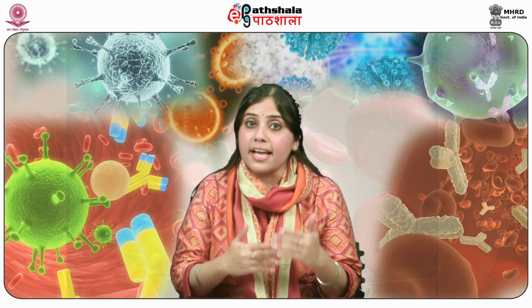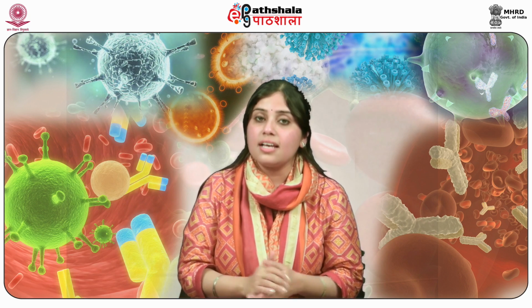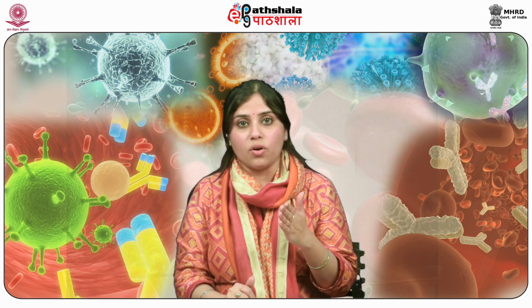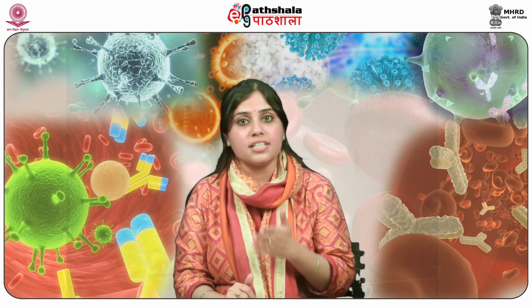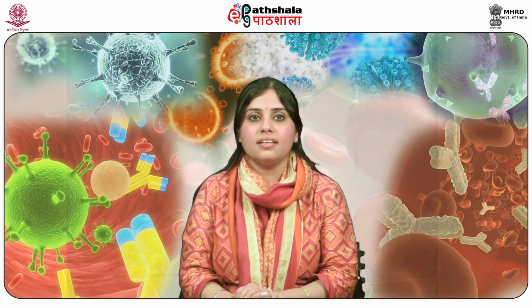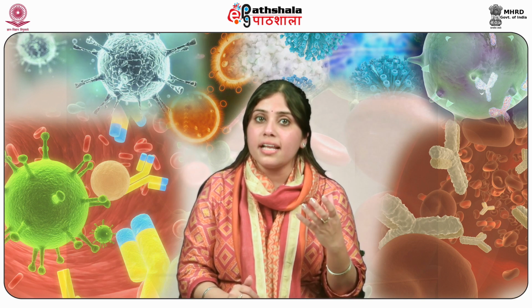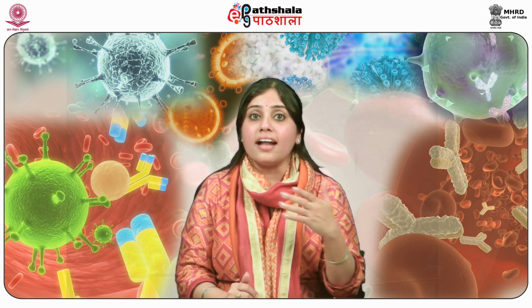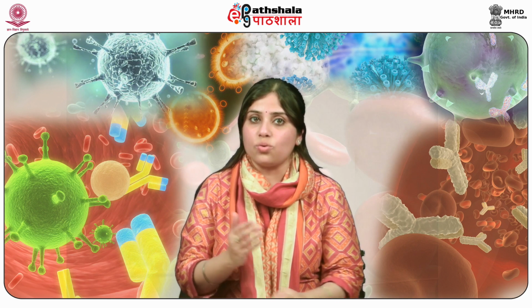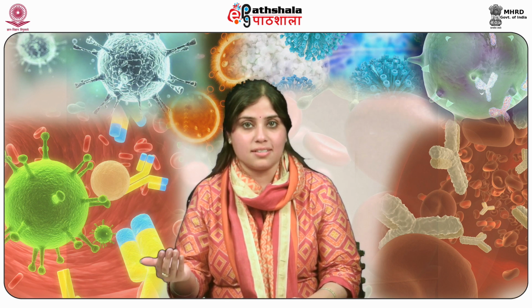In order to detect the non-agglutinating antibodies on erythrocytes, a second antibody directed against the antibody attached to their respective epitopes on the erythrocyte is added. This anti-immunoglobulin can now cross-link the erythrocytes and result in agglutination. This test is known as the Coombs test or anti-immunoglobulin test.